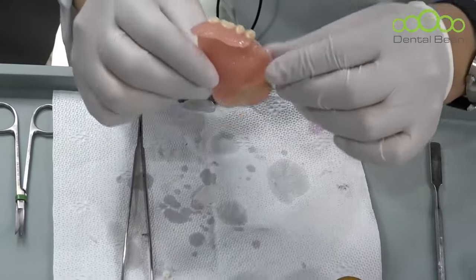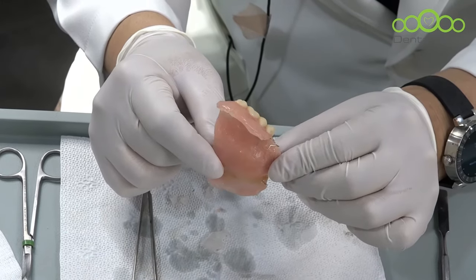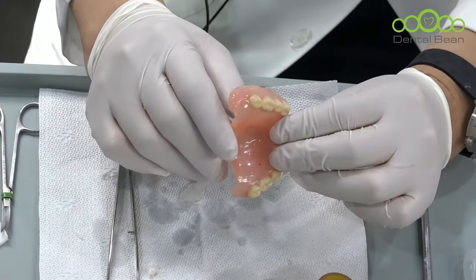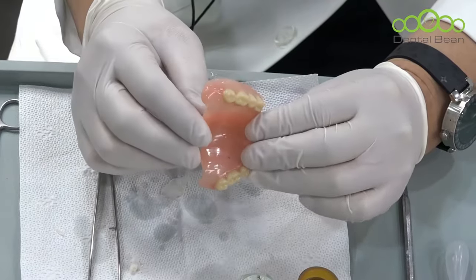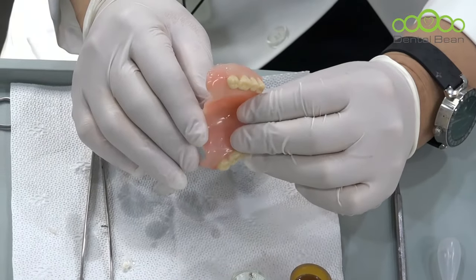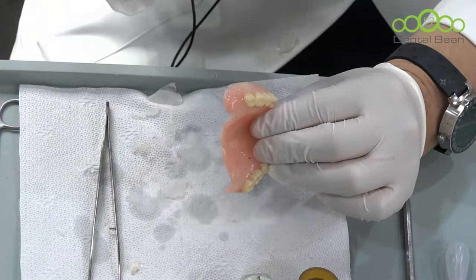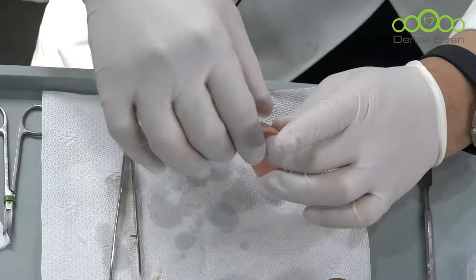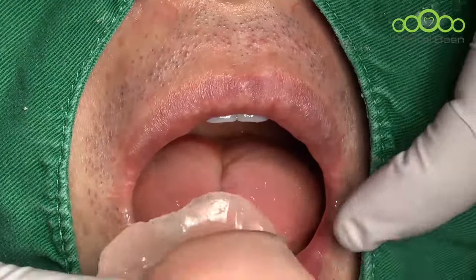As you can see, the excessive resin was removed thoroughly, and it is very clean. As you know, after a certain period of time, this soft liner tends to be detached from the porous surface, and then some kind of food debris gets stuck inside there. So I often apply this kind of solution to let the soft liner stick tight on this porous surface and make it clean for a long time. And I will insert the denture in the patient's mouth again.